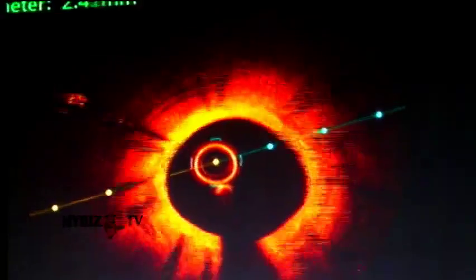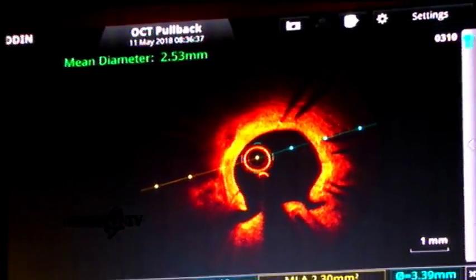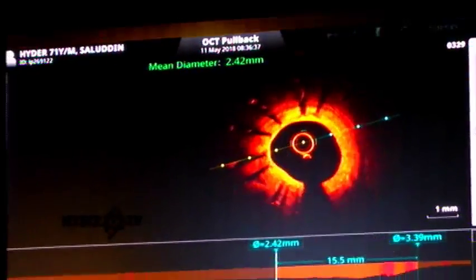So how do you think about the landing portion? You try to put here, this might be the best position, right? Yeah, landing. Yeah, so 2.5, right? Here. Hello? Can you hear me?